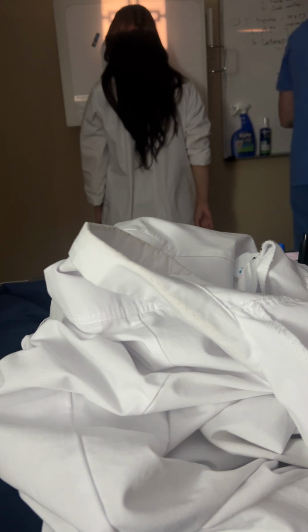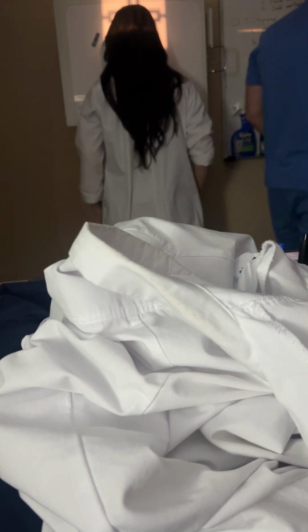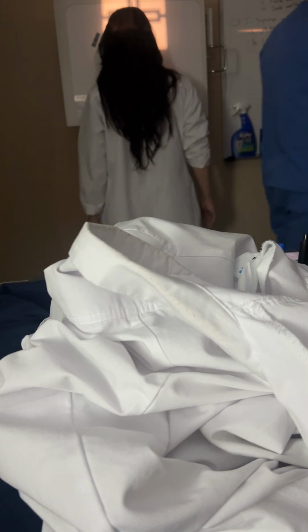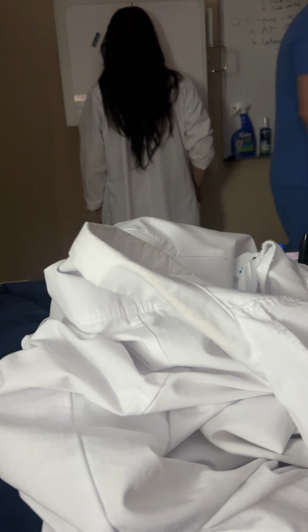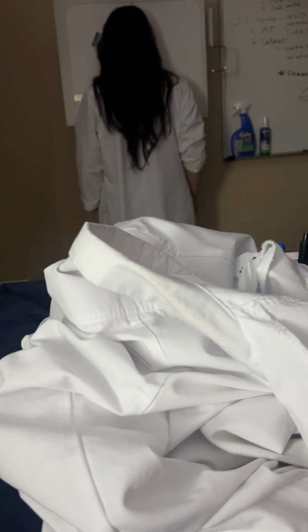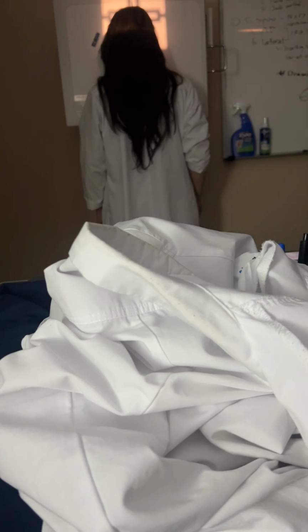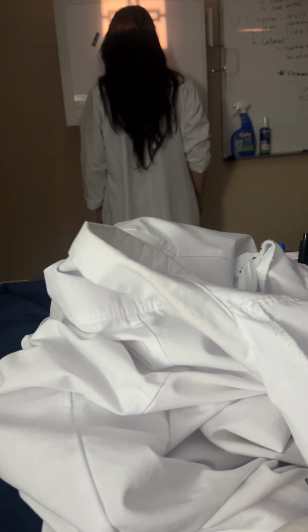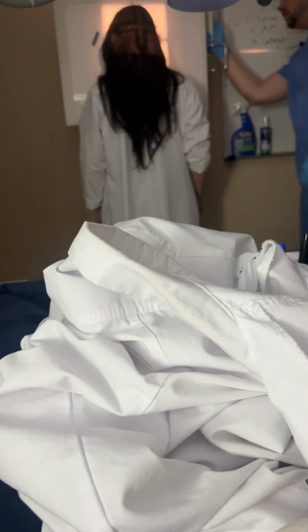Very important consideration for a Caldwell skull is that the petrous ridges are in the lower third of the orbits. For a straight PA with no angulation, the petrous ridges fill the orbits. Orbits, the eye sockets. The petrous ridges are right back here, if you look inside the skull. You're shooting to put those in the lower third of the orbits. Where does your CR exit for a Caldwell method? Nasion. Very good.